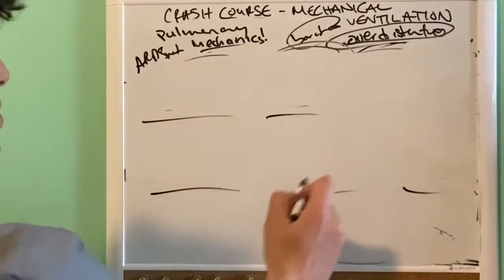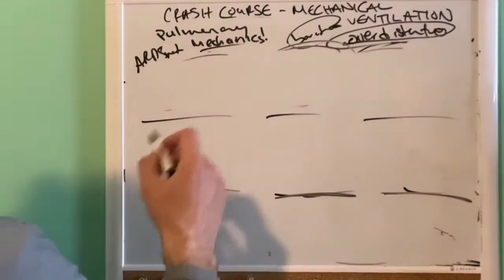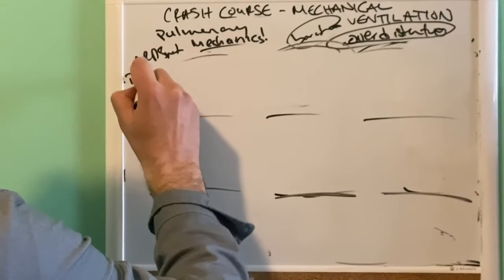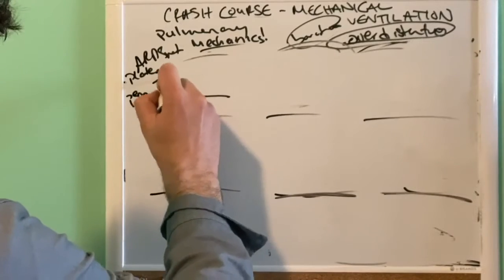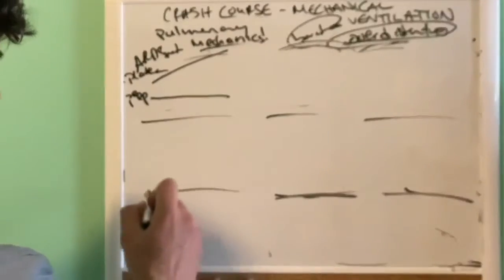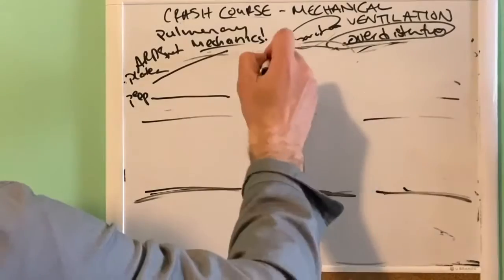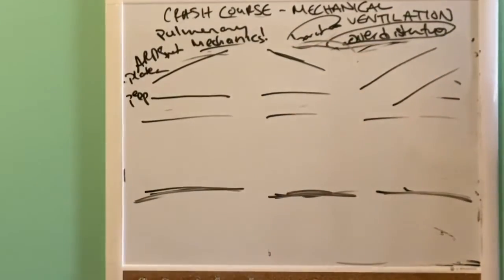And so just imagine, from the knowledge that we have, or the knowledge that you may have been taught, let's say this is a measure of your PEEP and your plateau pressure, right? Let's say your PEEP is staying the same and your plateau pressure is going up. I think Amato and Brower at Hopkins put out a paper, which I can send too. And then let's think of a situation going down. Any PEEP's the same. Let's say they're both going up. All right.